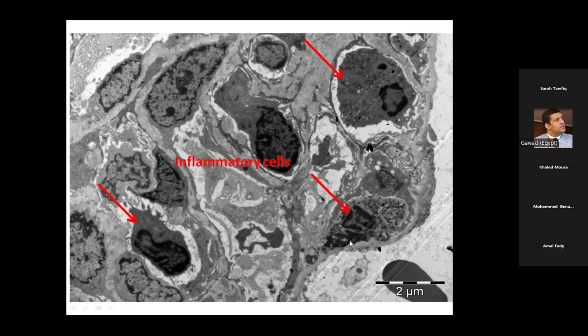Okay, segmented nucleus means this nucleus has multiple segments. When we have a cut in it, it will appear as if it is two nuclei, but actually they are connected to each other somewhere. But we did not pick it up in this cut. Okay, this is its cytoplasm full of lysosomes. Yes. Okay. Can you catch?